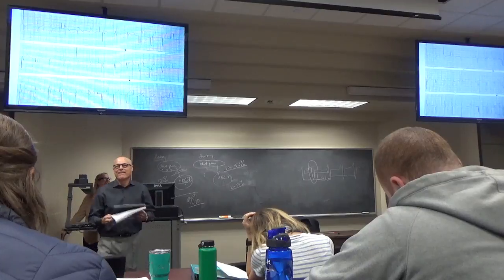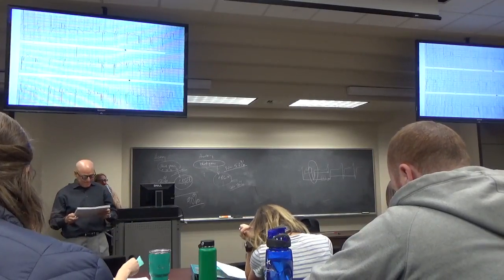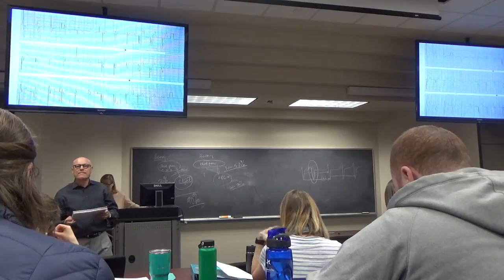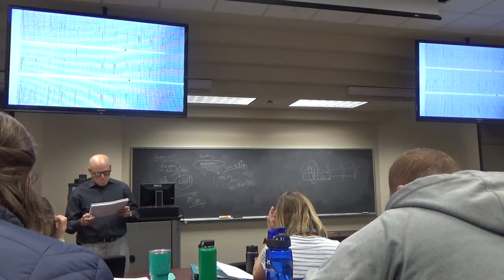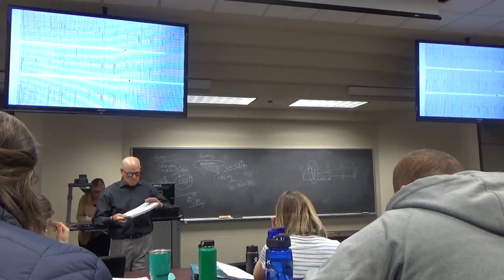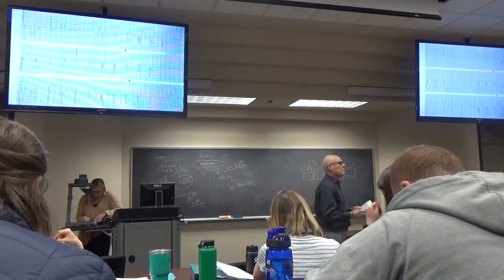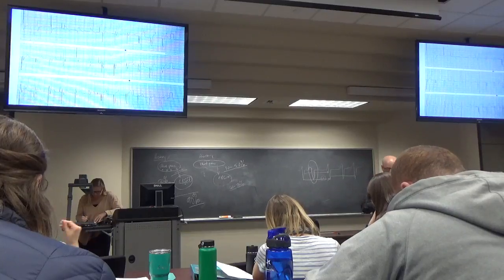I didn't know how to describe the rhythm because I didn't see a P wave. But it is regular. I got a heart rate of 75, a QRS of 0.16, QT of 0.24, and the QRS frontal axis I got normal.